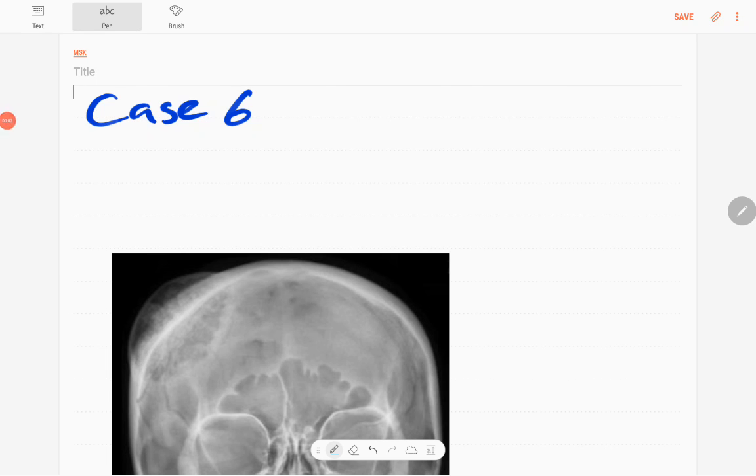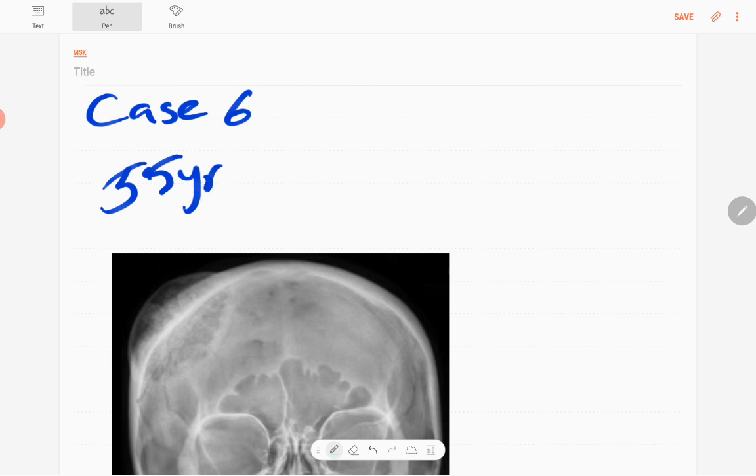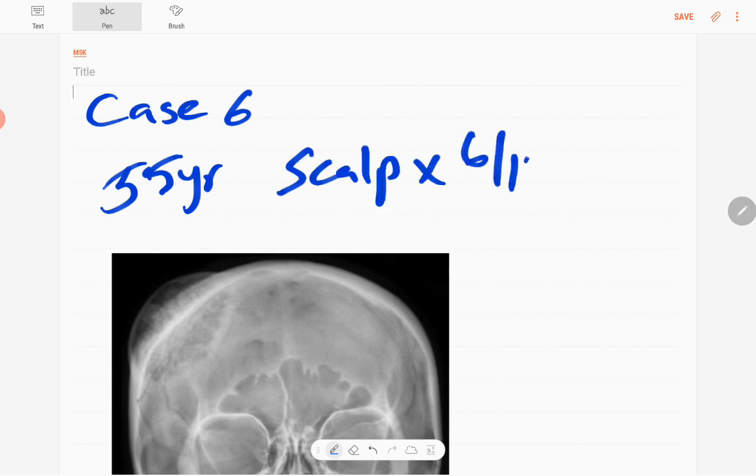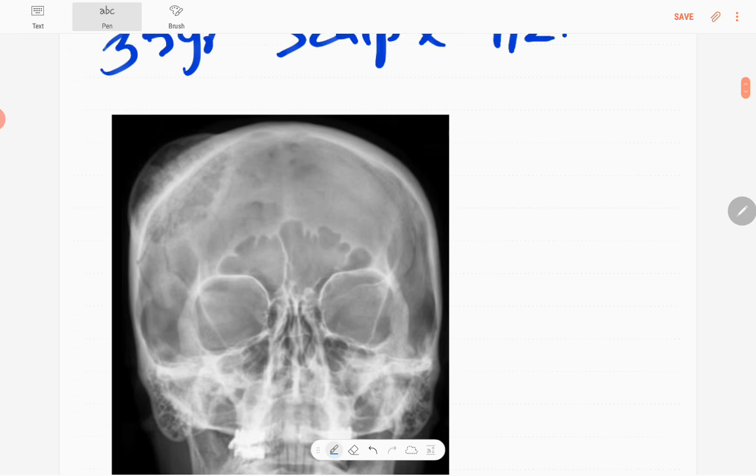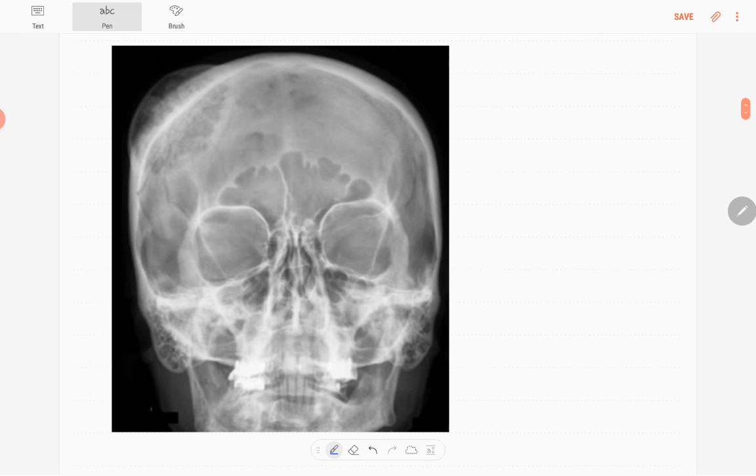Hello everyone, this is case number six of MSK series. Today's case is a 55-year-old patient presenting with a progressively enlarging scalp lesion for six months duration. This is his anteroposterior radiograph of the skull in this skeletally mature patient.